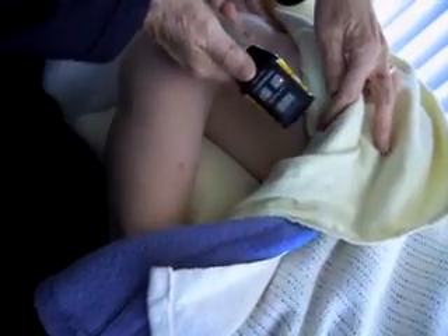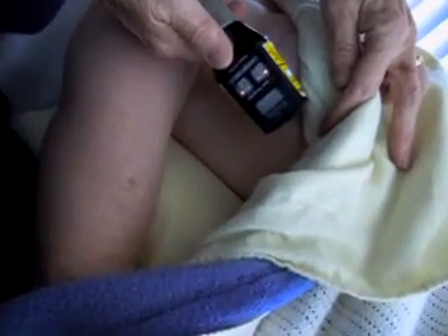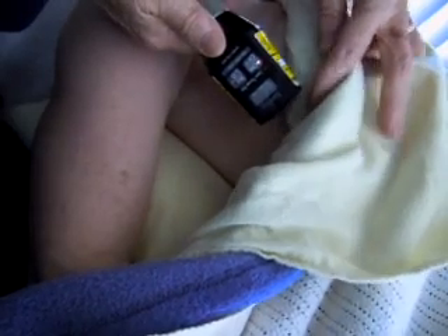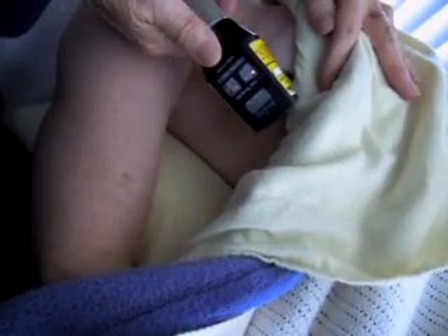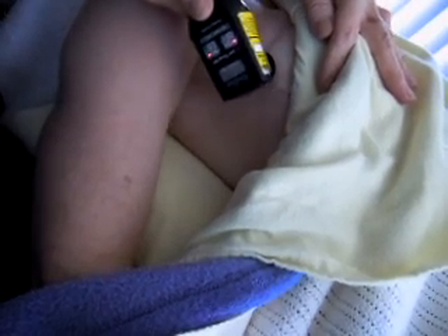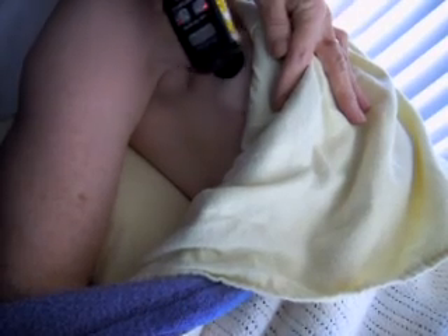So the scar — we'll treat the scar, just holding the laser onto the scar and treating it for a minute a point. And we just move it to the next point, and then again using a minute a point.